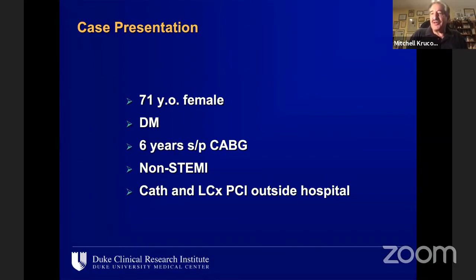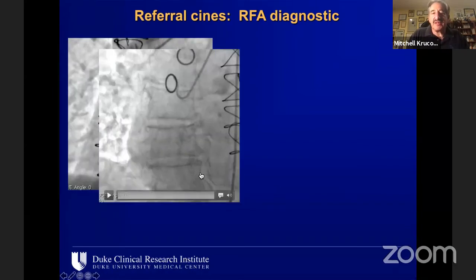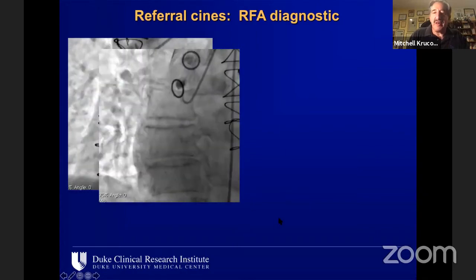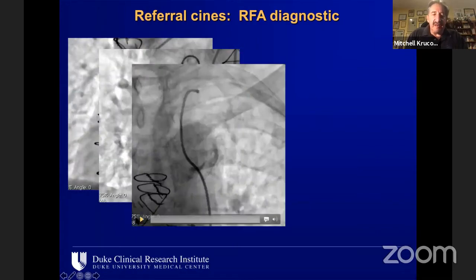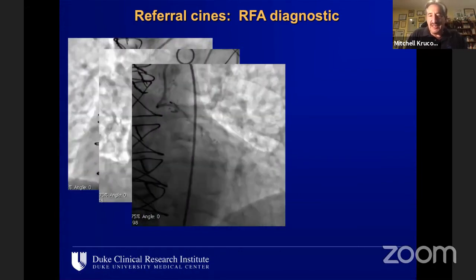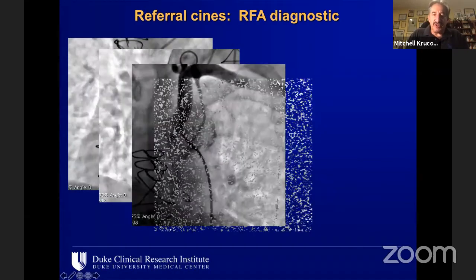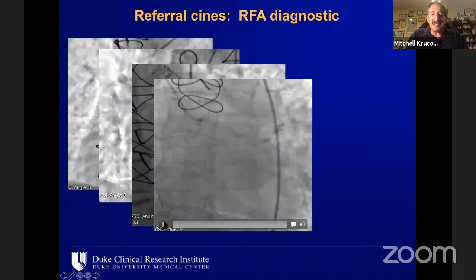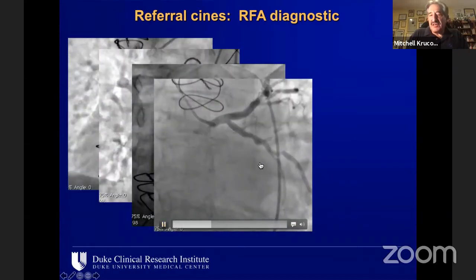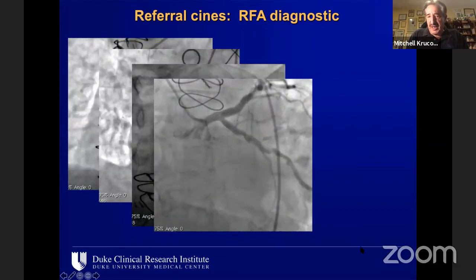This lady presented to a hospital about 90 miles from our medical center with a non-STEMI and underwent catheterization and PCI. I'll show you. You can see the vein graft to the circumflex system is occluded. The vein graft to the right coronary artery is occluded. The mammary, this is not a great picture, but I think they sufficiently imaged that the mammary to the LAD is intact, and I think we could impute the LAD is in reasonable shape. The native circumflex, you can see, is diffusely calcified, but has a very discrete lesion before this very large marginal branch.